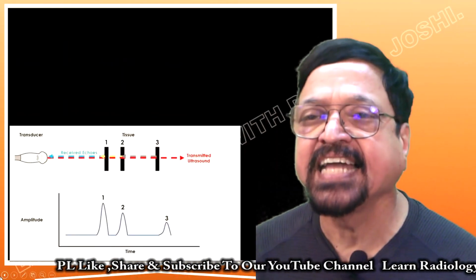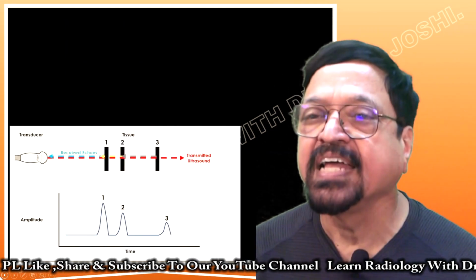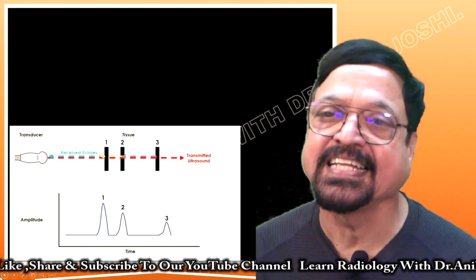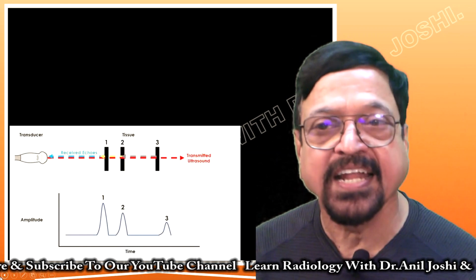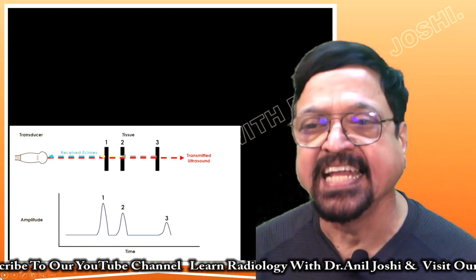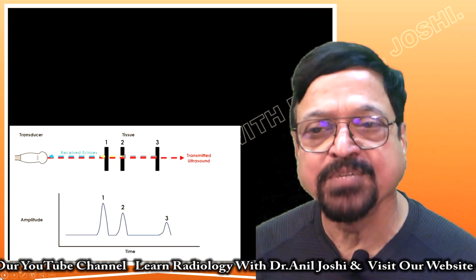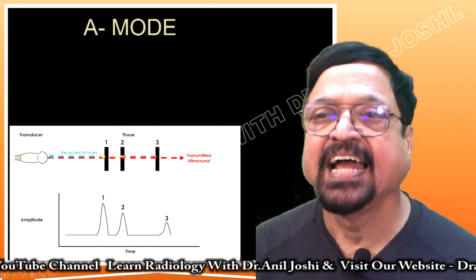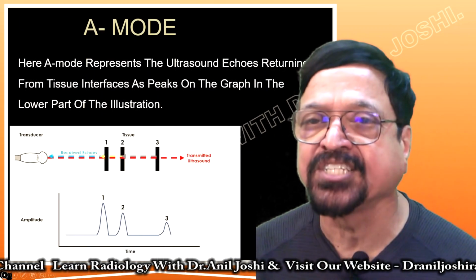Here we can see the transducer producing a wave which is propagating. The first obstacle it faces is 1, which is strong, so the amplitude coming back is stronger. Then there is 2, which is not as strong, and then 3, the third. You can see the distances between these three objects by the timeline, and depending on the echoes you can know the constituent of that structure.